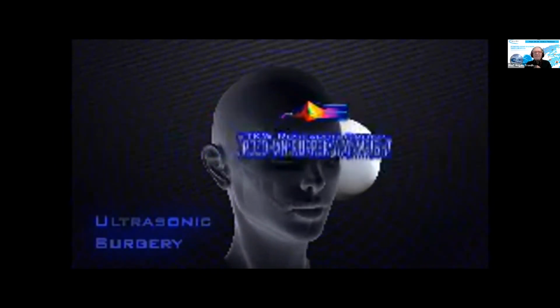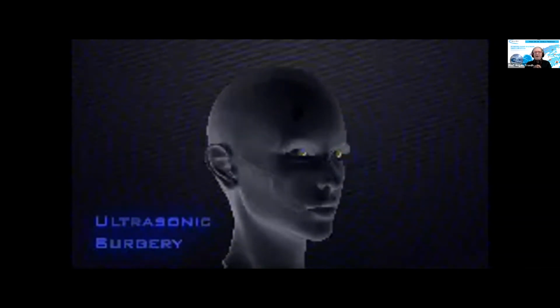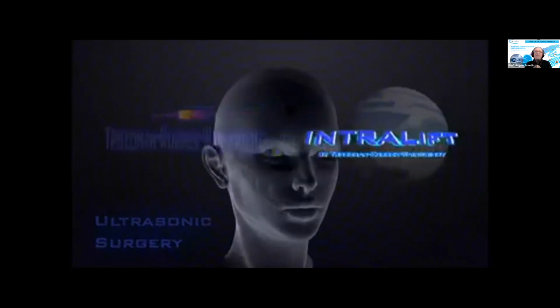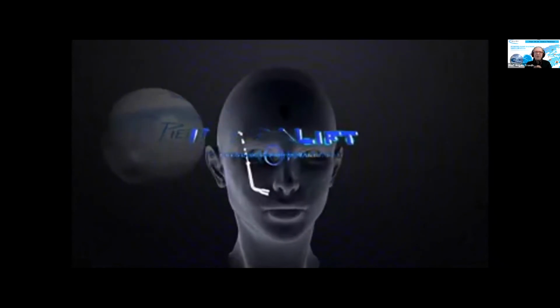So I already presented you the case you've seen before in the CBCT planning. We have a narrow alveolar crest in the upper incisor alveolar ridge area and premolar alveolar ridge area, and we have only remaining 4 to 4.5 millimeter of subantral alveolar crest height.